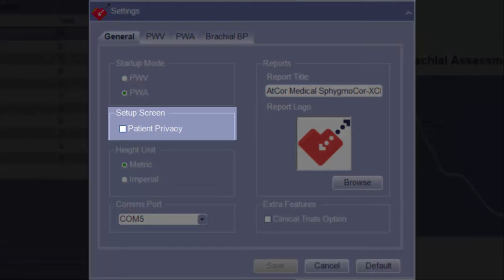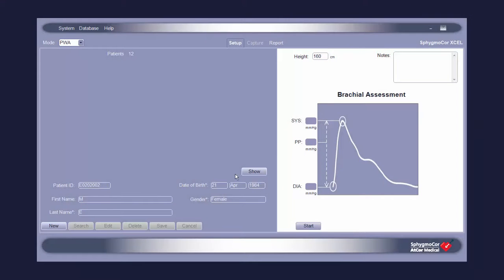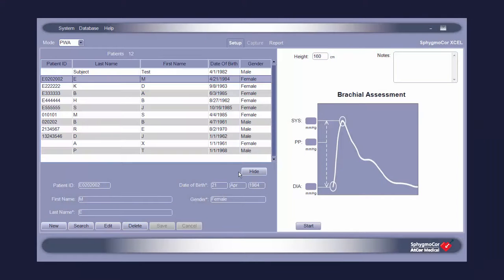Under Setup Screen, it is possible to enable patient privacy so that patient identifying information on the setup screen will be hidden by default. Click Show to display the patient information. It can once again be hidden by clicking Hide.